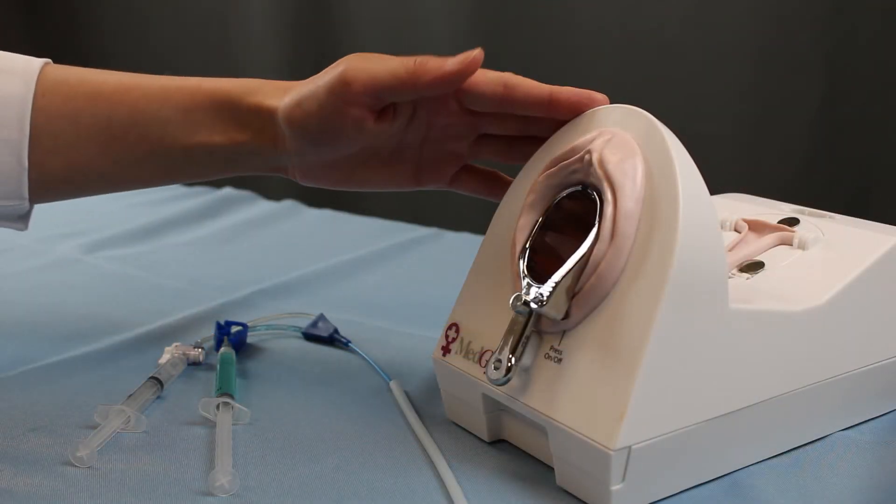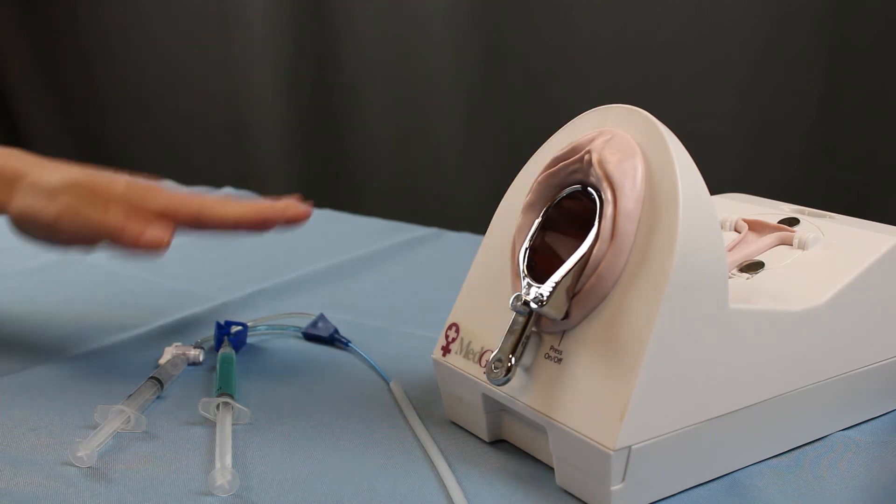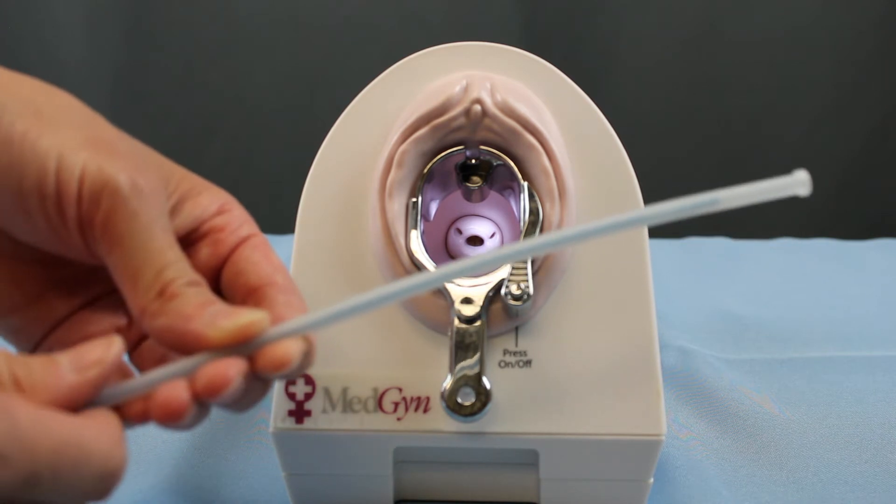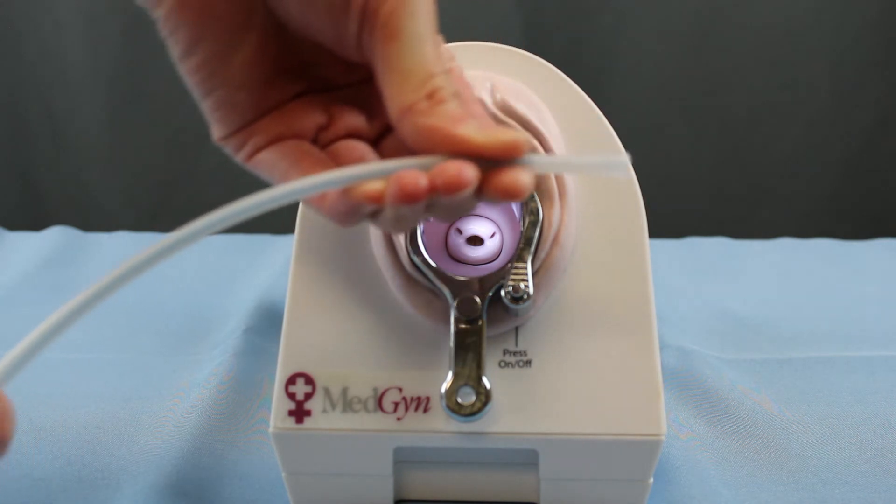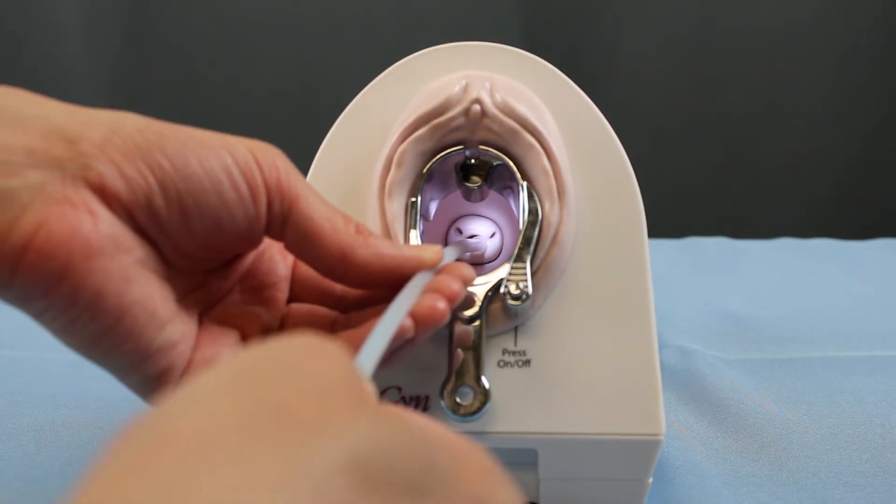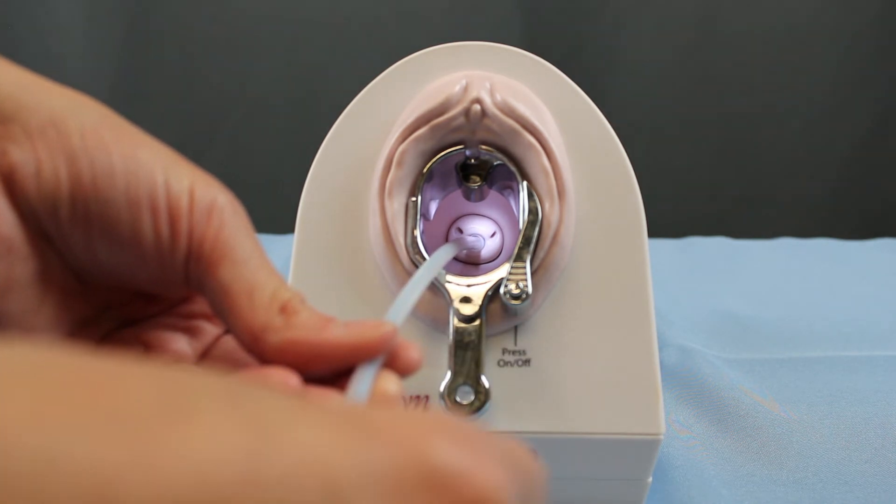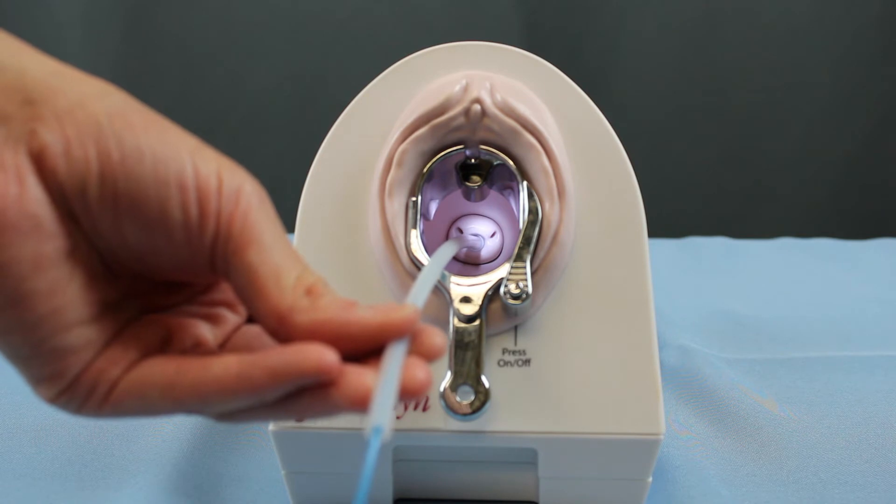Once the patient has been prepped for the HSG procedure, placement of the HSG catheter can commence. After visualizing the cervical face, gently shape the introducer placement sheath to suit the patient's body. Set the catheter and sheath against the external os of the cervix. Once aligned, advance the catheter through the cervical canal and into the uterine cavity.